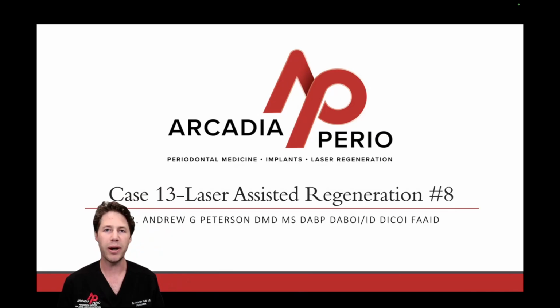Do you find periodontal defects in the anterior aesthetic zone challenging to manage and challenging to get aesthetic results? Traditional GTR type procedures with bone graft and membrane often lead to papilla shrinkage and interproximal defects, with the papilla shrinking, with an unideal aesthetic outcome.